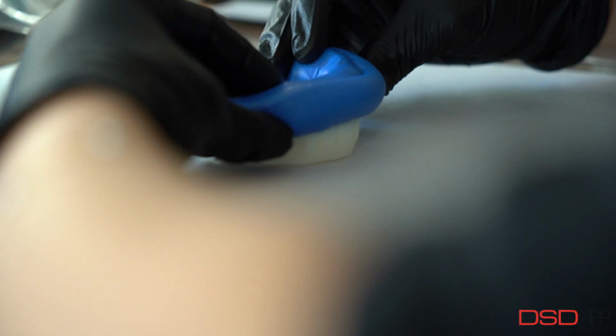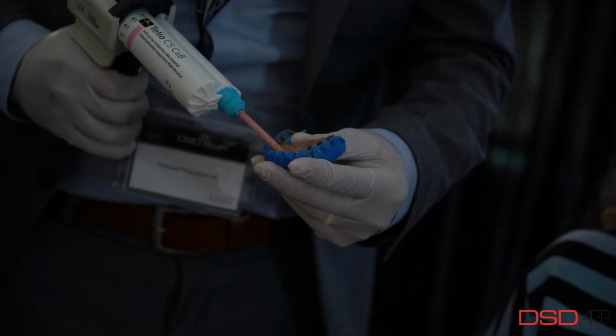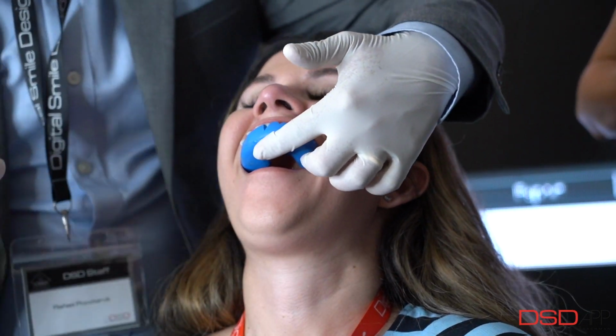After you've printed your 3D model, you're ready to transfer the mock-up to your patient's mouth. The first step to doing so is creating a putty matrix or a silicone key that will help you transfer that smile into your patient. Inside of the silicone key, you're going to inject some bisacryl material and put it into your patient's mouth. Let it set for a couple of minutes and remove the key.